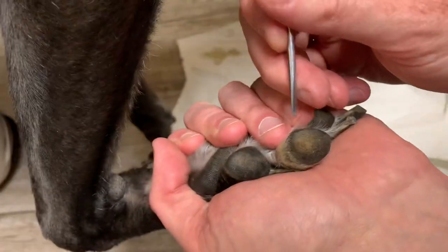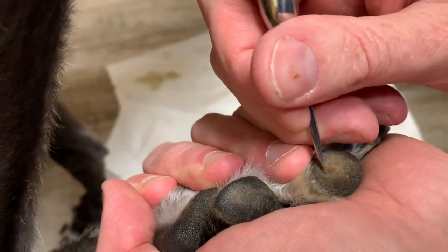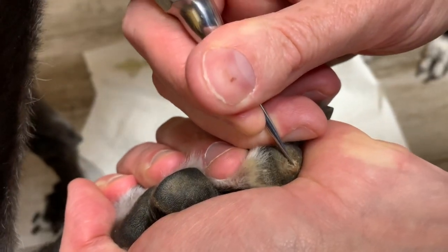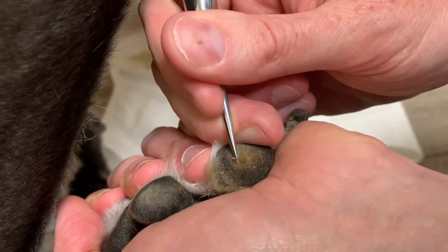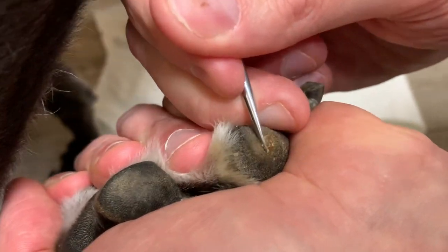You can see the corn outlined here. Come around on the outside with the root elevator. Let's apply some steady pressure, and it'll literally lift off at the depth that you need it to.